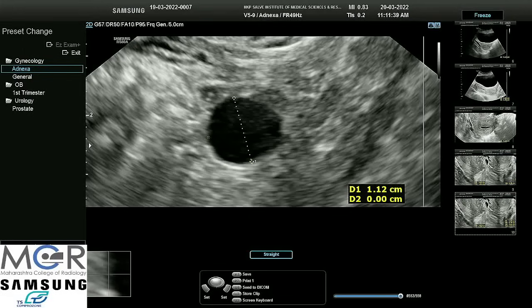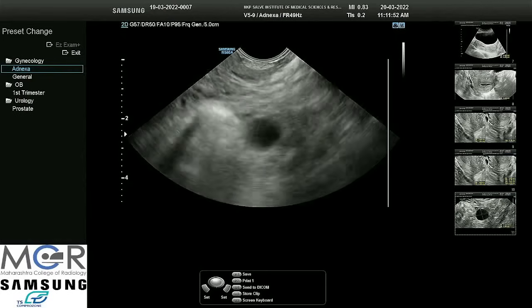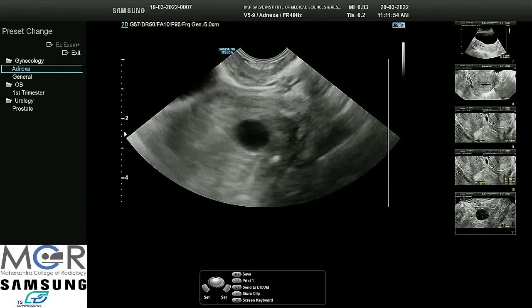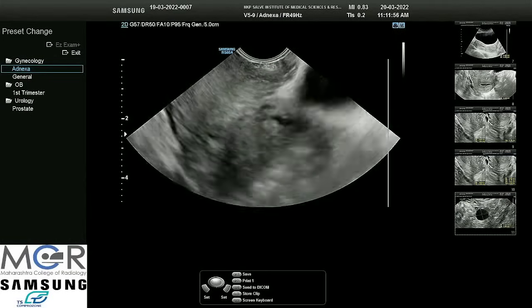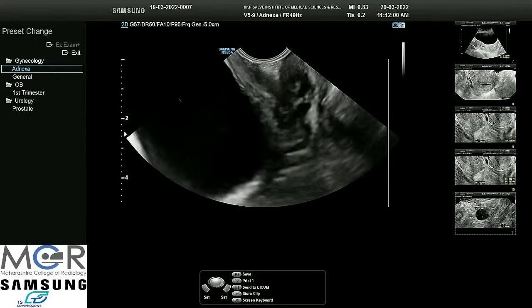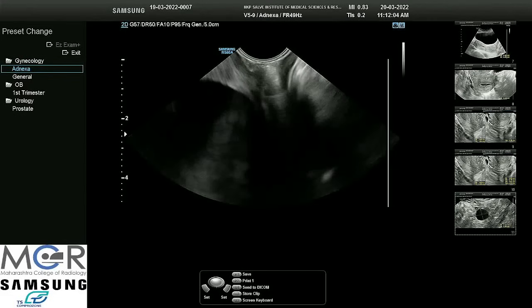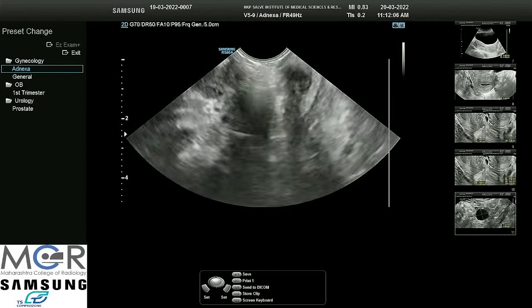The endometrial thickness is not much, so even if she is getting one or two spottings, she must not be realizing it is a period. But her gynecologist will see into it. We have to just report our findings — we are not the treating doctor. I am withdrawing the probe, and this completes our examination.